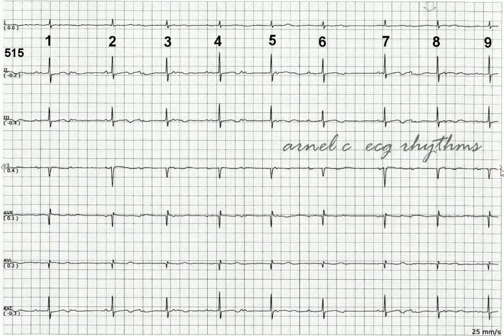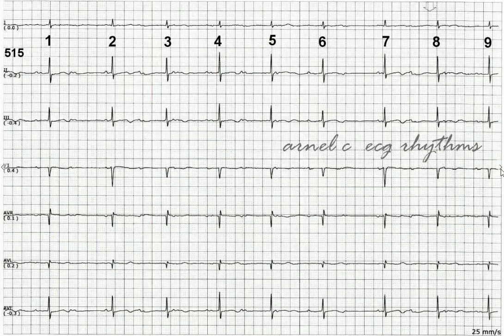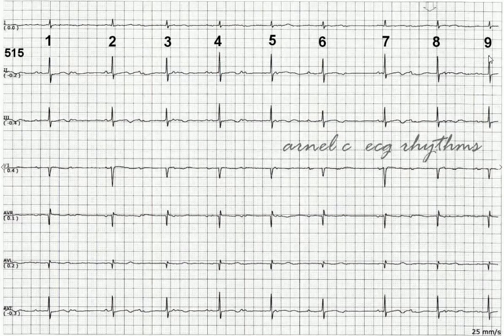Here's a simple way to approach this arrhythmia. Number one, it's good practice to number your QRS complexes. This will make the descriptions easier later. There are nine QRS complexes, and the P waves are all over the place, but they're still regular.